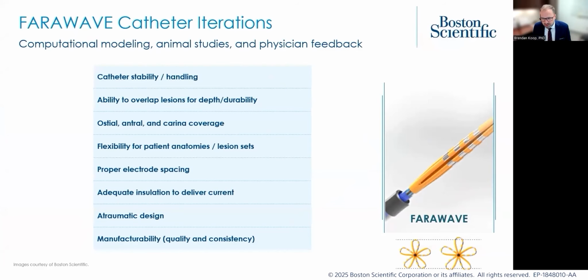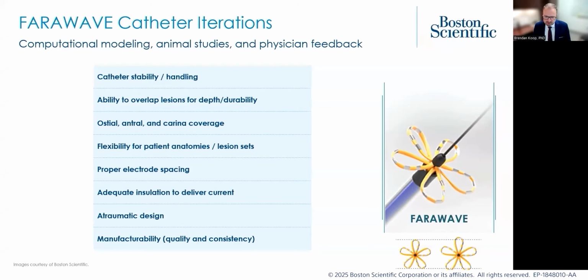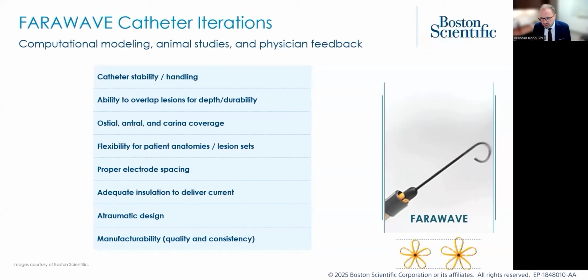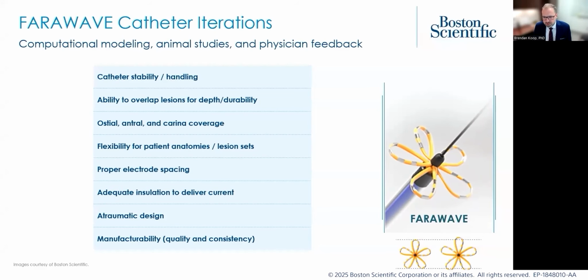And that catheter has everything about it specifically chosen for pulse field ablation. It has 5 splines so that we properly space out the electric field, and we're able to form this flower form factor, which is a useful form factor in addition to the basket. The electrode size, spacing, and number of electrodes are all specifically chosen to optimize and hit that very tiny design space.